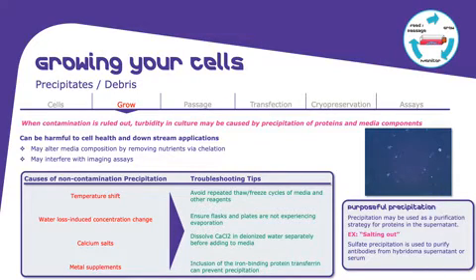So if you rule out the contamination, but you still see cloudiness in your media, it might be precipitation of some proteins or other components in the media. It can be really harmful for the cells and very harmful for your downstream application as well. So it is very important to identify what's causing these kinds of problems.